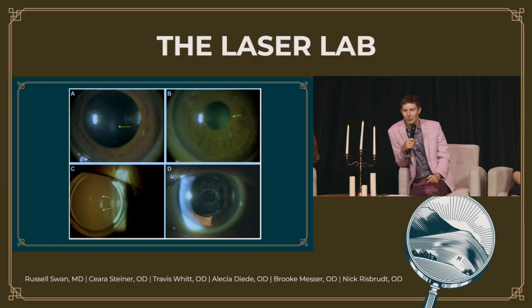So what we're looking at is the cornea, and this is kind of like sequential images. The top two are the day somebody had a YAG, and then the other ones I think are at one month and three months, as I recall. Any idea what happened here? This patient had a YAG when they came in, not by me. They YAGged the cornea.